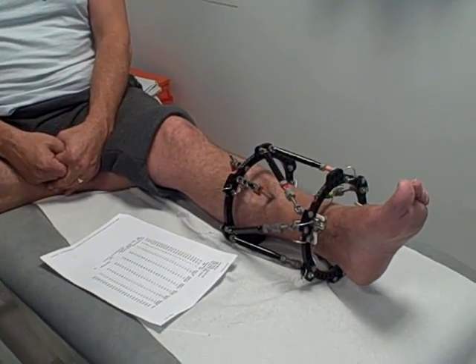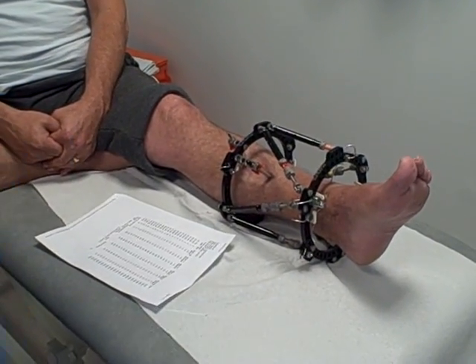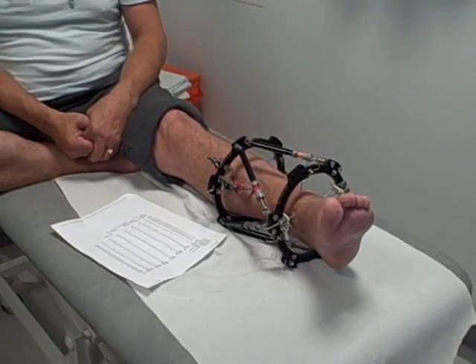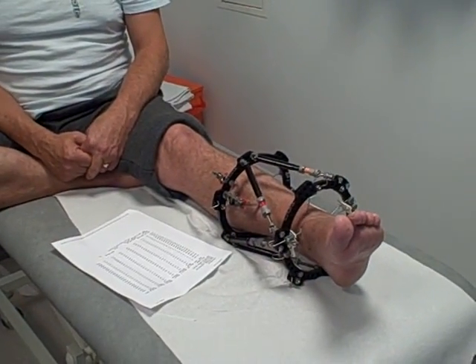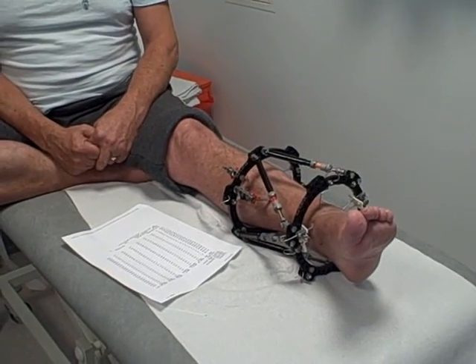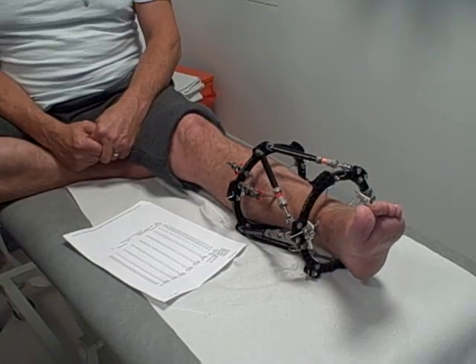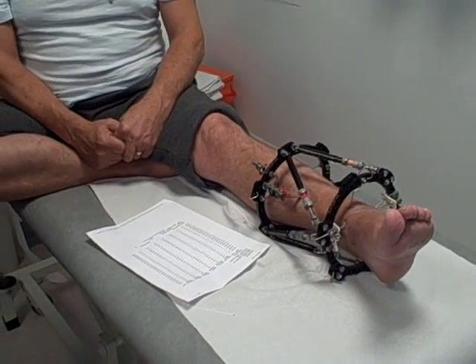Okay John, so we're just going to talk a little bit about how to adjust your struts, and Debbie's going to talk to you about the prescription which we prepared from the computer formula.